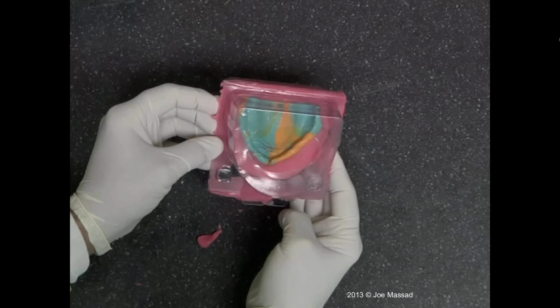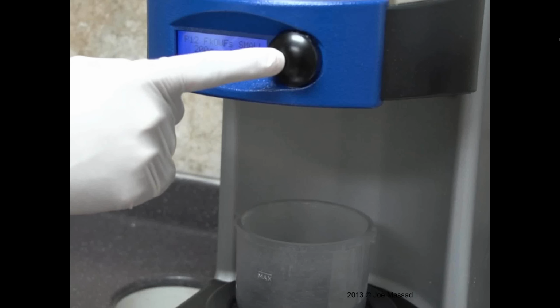I'm using 200 grams, so it's going to dispense the water automatically, and then it's going to dispense the powder. While it's dispensing, it's actually vibrating to make sure it sifts and there's no clumps and it's all dry. So it will actually let you know when it's at 100%.